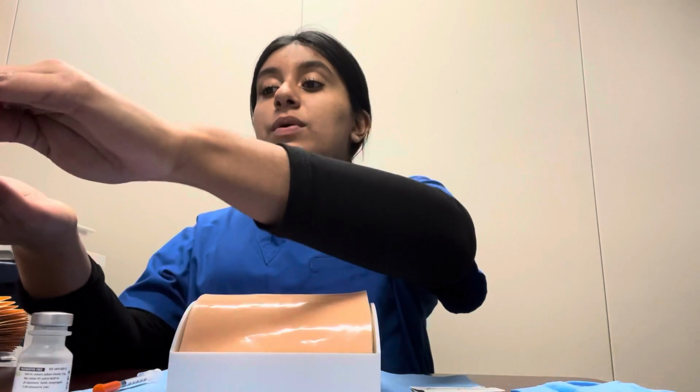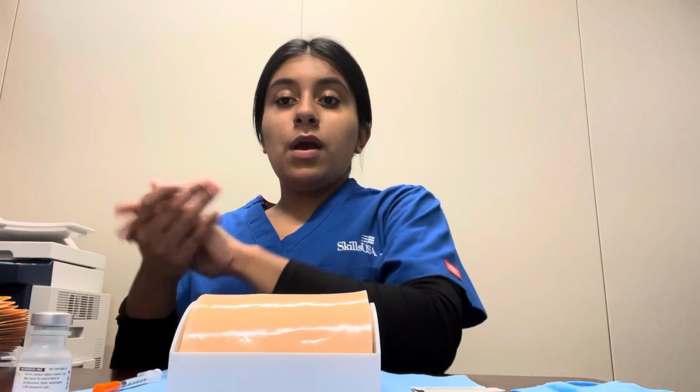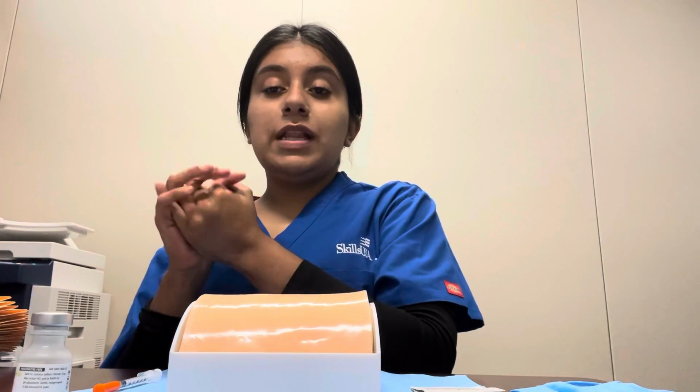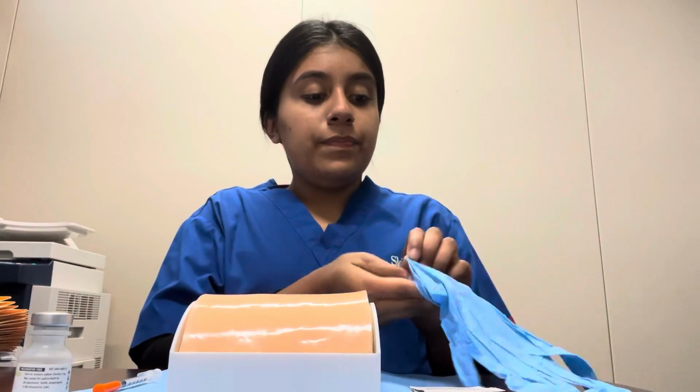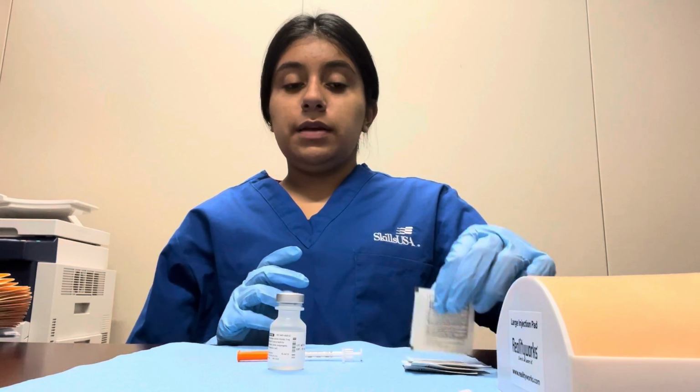We will first start with washing our hands, but for this occasion, I will be using gel. We'll make sure to wash our hands very well for at least 20 seconds. I will now be donning my gloves. Will now proceed to grab the amount of insulin needed.